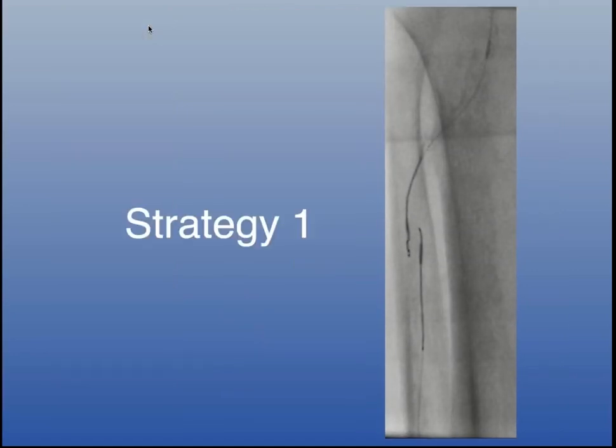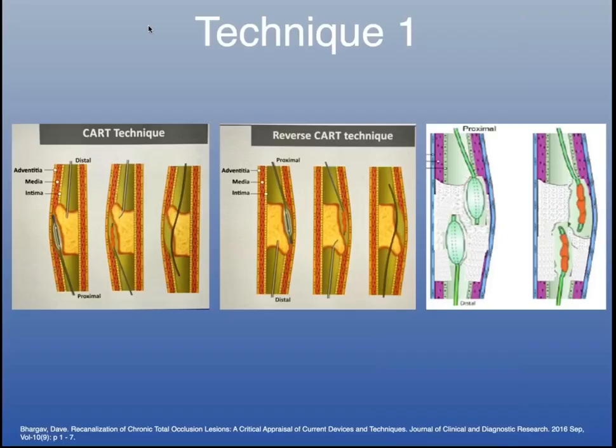So there are two strategies to deal with this. Here's the first few you can use. You can do these, what they call CART, reverse CART, and the double balloon or SAFARI technique.